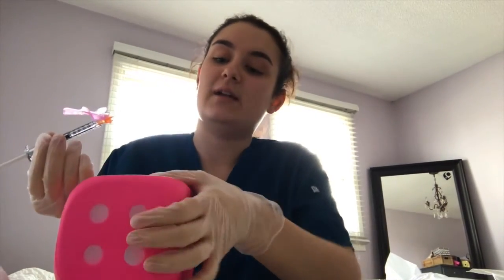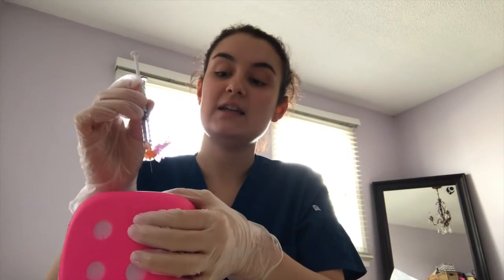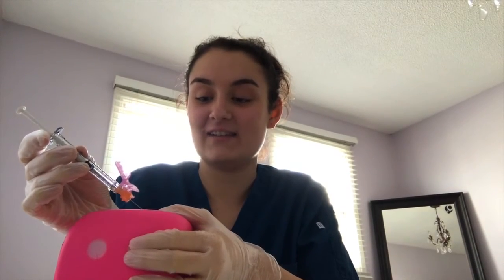I have it in my hand and I'm pinching. I'm trying to pinch. This is a hard dice. Okay. So I'm pinching, all right? So let's say you pinch really good. That's how I usually do it. I pinch really good so that I have a nice bump of subcutaneous tissue that I'm pinching up. And I tend to go in at 90-degree angles if I'm pinching well, but they say you're supposed to go in at 45. I don't know. Just do what feels right. Okay, and in at 45-degree angles we go.